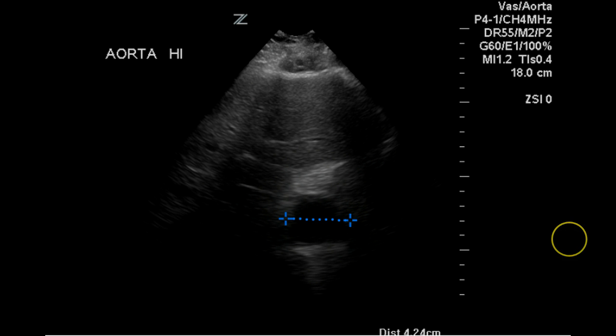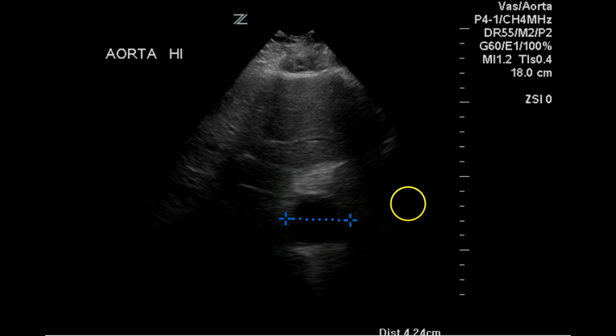In transverse, the proximal aorta measures 4.24 centimeters. Again, it may be mildly overestimated by caliper position, but this is definitely greater than 3 centimeters.